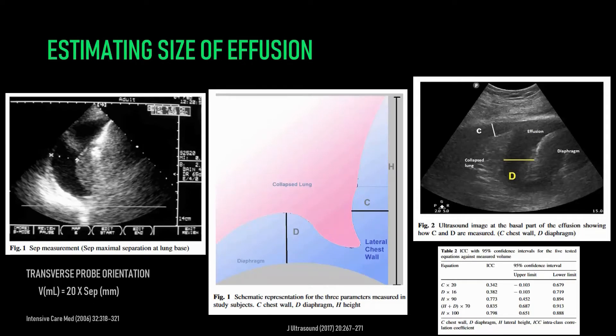Ultrasound is also important for estimating the size of the effusion. It's very important to take note of how large the anechoic space is between the chest wall and relevant anatomical structures you may not want to hit with a needle. You should generally take a measurement of this. On the screen left, there's a technique using a transverse orientation of the probe — that is, with the probe marker oriented perpendicular to the patient's longest axis. You can get a simple estimate of the effusion size by measuring the separation between the chest wall and the remaining lung tissue and multiplying that by 20, giving a volume in milliliters.